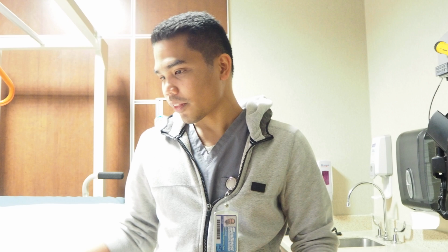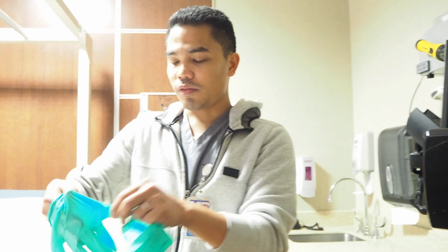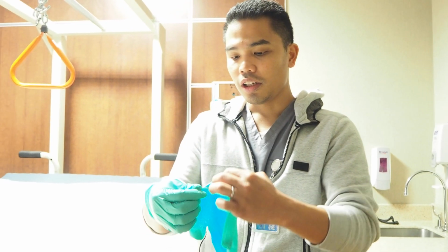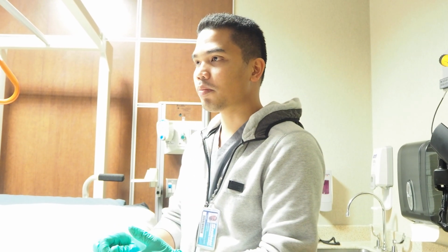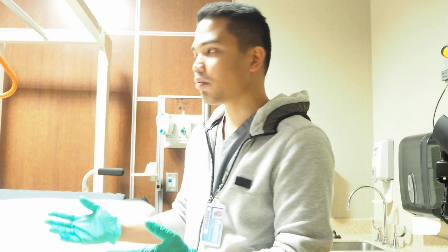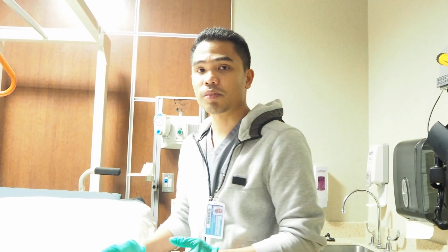So after that, wash your hands also, and then wear appropriate PPE such as gloves. So after we're doing those, we always make sure we do our set of vital signs, assess the patient, make sure we always perform an auscultation, which is really important for this therapy. And then if the patient is elderly, or depending on what type of patient, we can ask the patient if they can sit upright. If not, we can assist them or adjust the patient's bed.